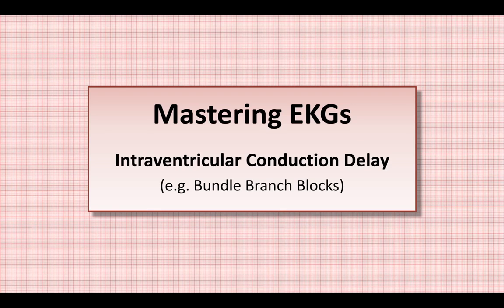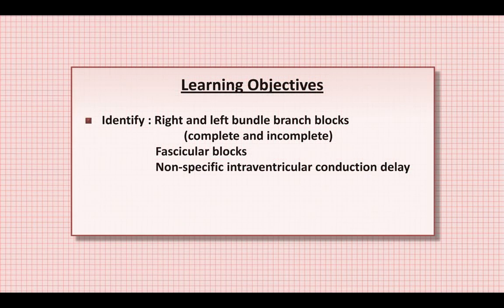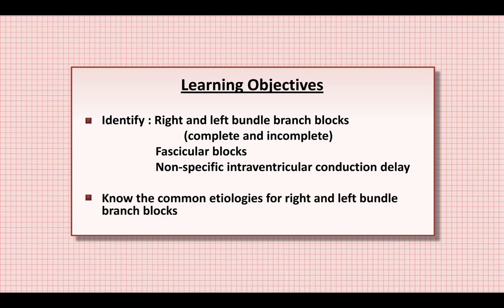Hello. Today's topic will be intraventricular conduction delays, which most notably includes bundle branch blocks. At the end of this lecture, you will be able to identify right and left bundle branch blocks and differentiate between complete and incomplete blocks, fascicular blocks, and non-specific intraventricular conduction delay. You will also know the common etiologies for right and left bundle branch blocks.